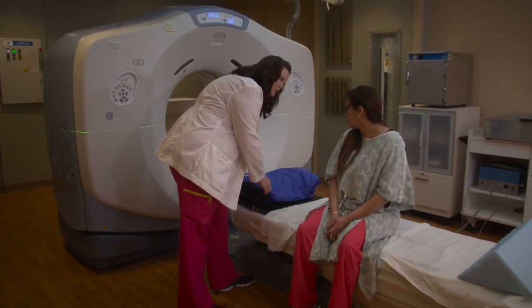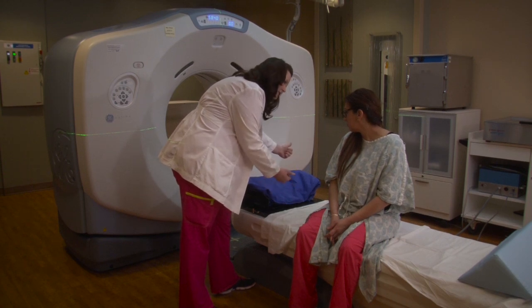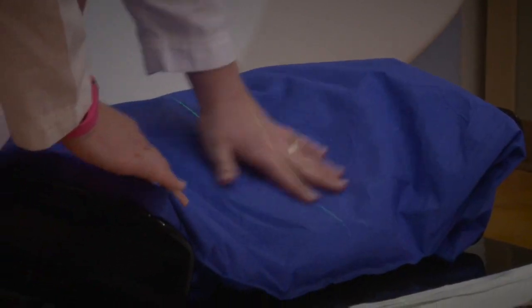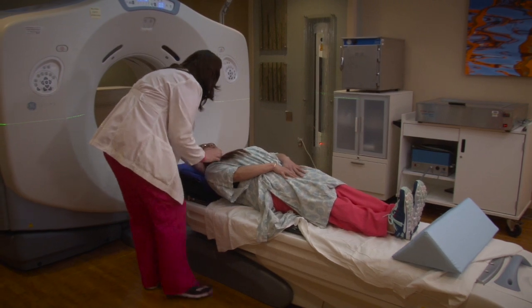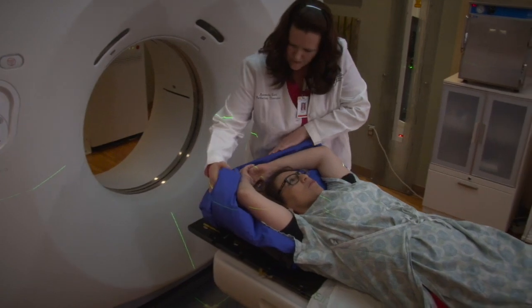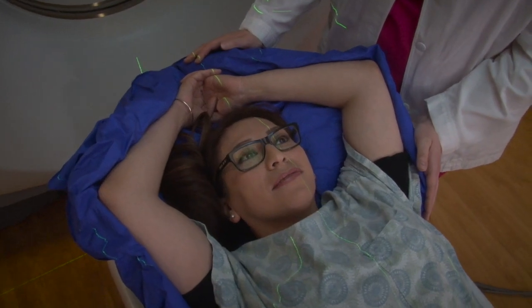Now, let's take a look at the vac lock. When we provide radiation therapy to the torso or body, we create a cradle or mold for this area with something called a vac lock. A vac lock is a cushion filled with small styrofoam balls. When we suck out the air from the cushion with a vacuum pump, the vac lock becomes rigid. We will place you on a vac lock bag, then vacuum out the air to create a custom form or mold that perfectly matches the shape of your body.